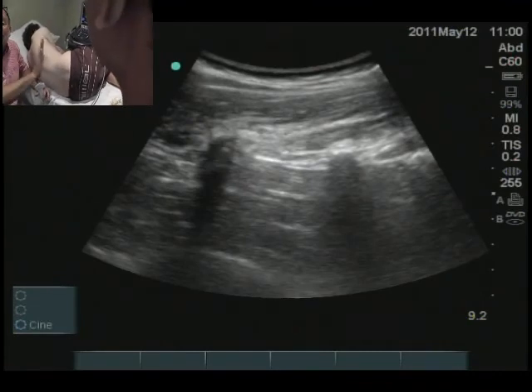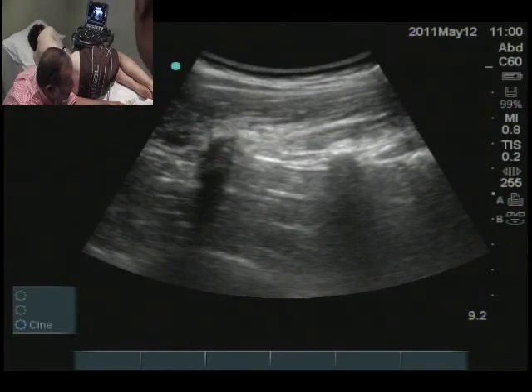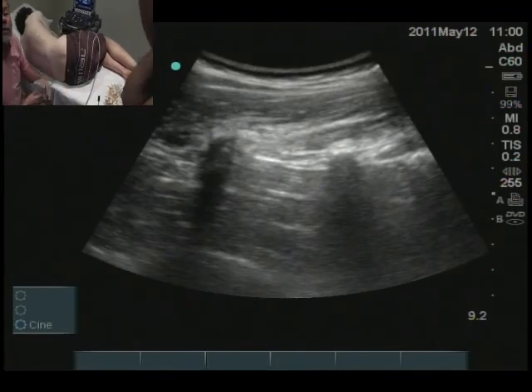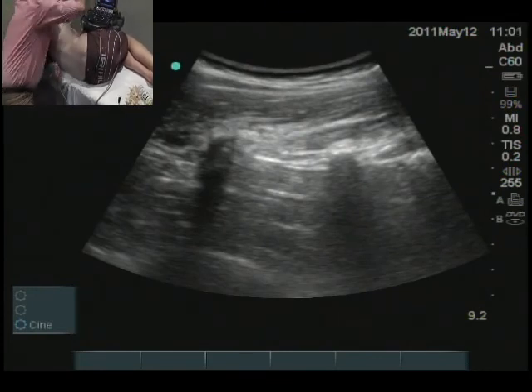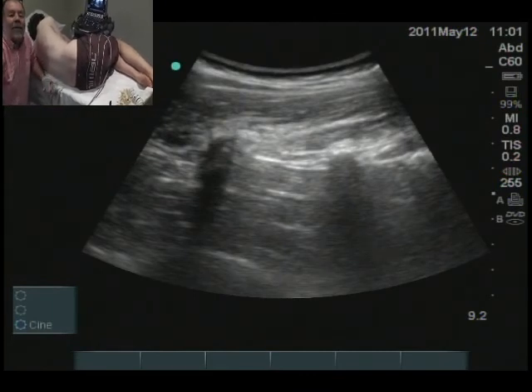So if it's deep to the tip of the transverse process, what we're looking at is we're looking like that. So if we see the tips, what we're then seeing is beneath it, and we're looking now in between those two. And so what we're seeing now is the psoas. And what I'm going to say to you is, there are the nerve roots going through the psoas. And you'll say, Barry's told me that because he's really clever, and so it must be true.